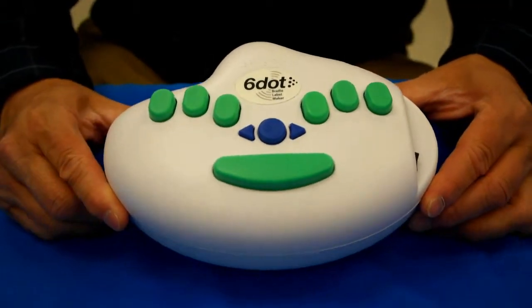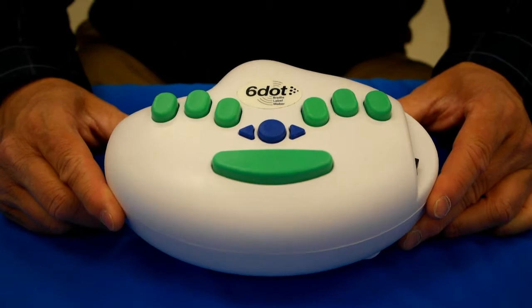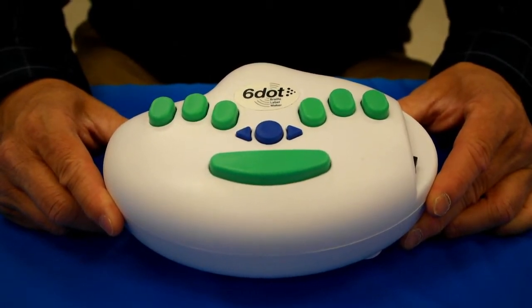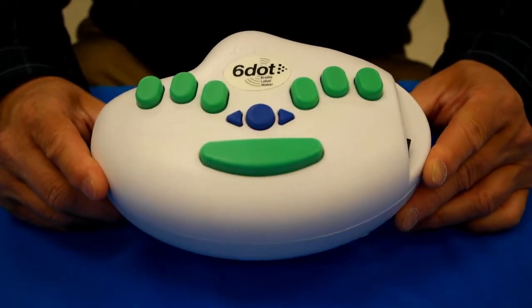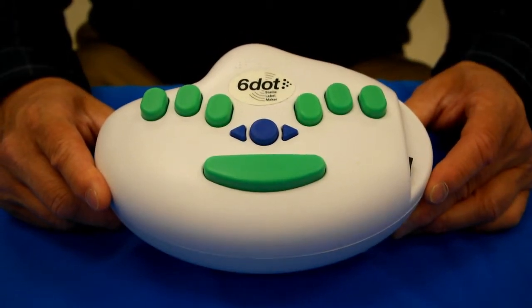This is the Six Dot Braille Label Maker. It's one of the most innovative braille label making devices the world has ever seen. It was originally developed at MIT in a student project, and we've taken this to another level by adding optical sensors at the tape inlet and outlet and an automatic cutter.